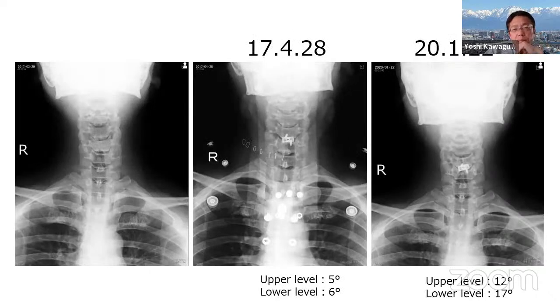The inclination of the device was seen during follow-up, although the subsidence itself is not related to worse clinical symptoms. The fusion tends to be delayed.